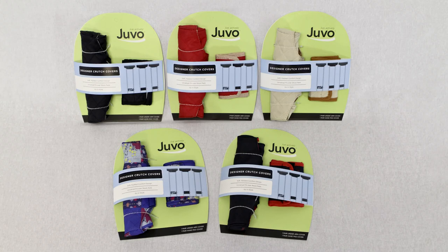Fashion black, fashion red, fashion tan, craft and sport.